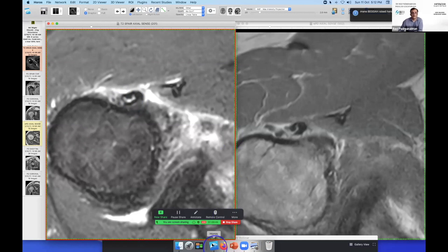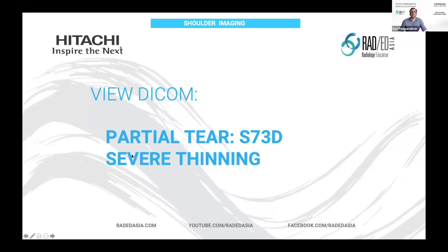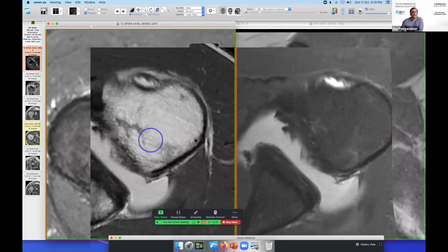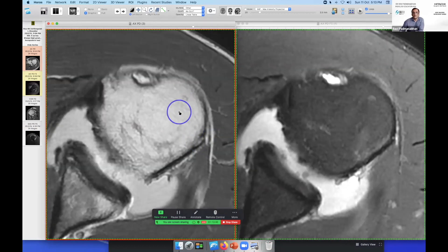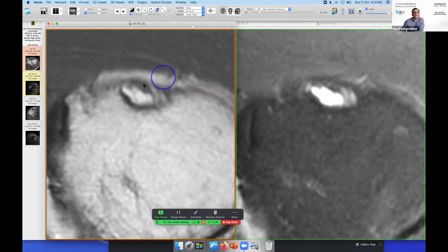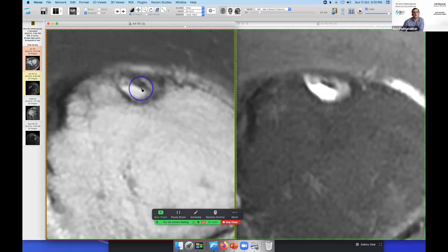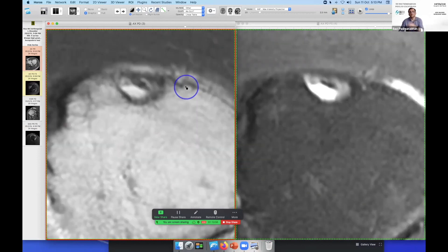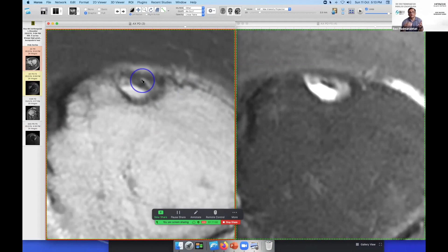Now let's look at the case with severe thinning. This patient has had an arthrogram, so there's a fair bit of fluid in the joint and there's also fluid within the biceps tendon sheath. But you can see that within the tendon sheath itself, this is the residual biceps tendon — it's way too small. So this is a different appearance of a torn biceps tendon where you've actually lost fibers and the residual tendon is very thin. This will eventually rupture.